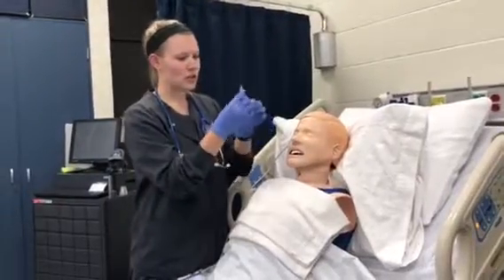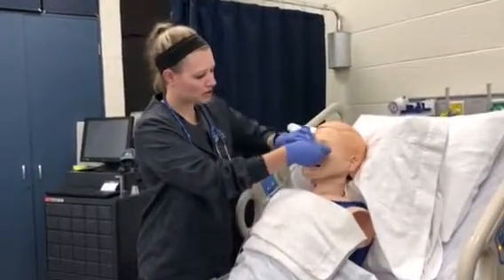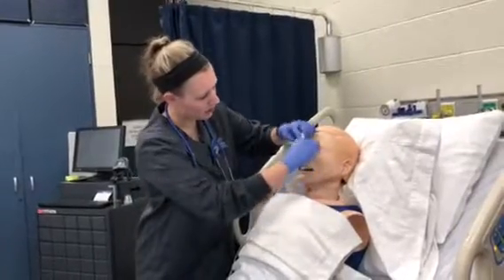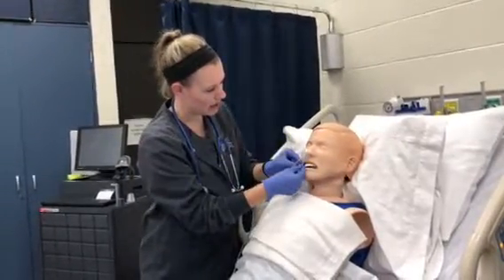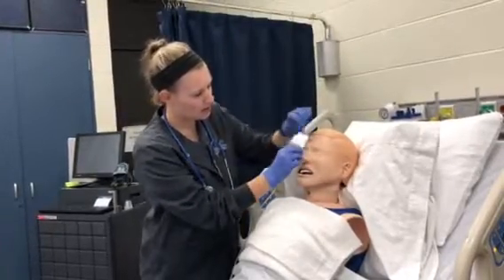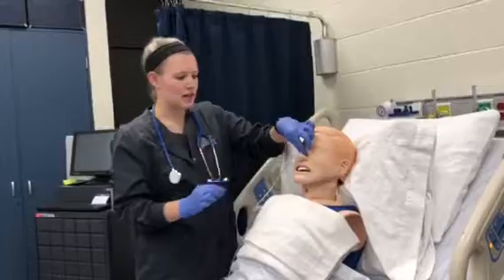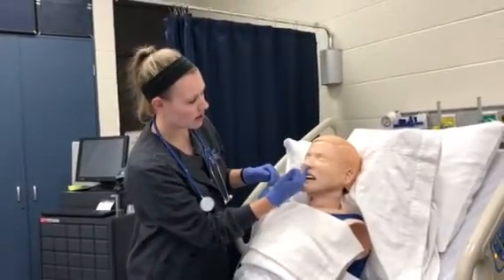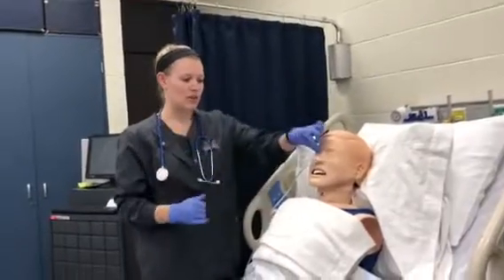What you can do is put the thicker part of the tape on the top of the nose, take one of the little pants and wrap it around and up and over, and the other one wrap it up and over on the other side. Sometimes you have to be careful because they can be diaphoretic and sweat off some of their tape, but you also want to make sure you leave some of the area for the nares to be open so that they can breathe as well.